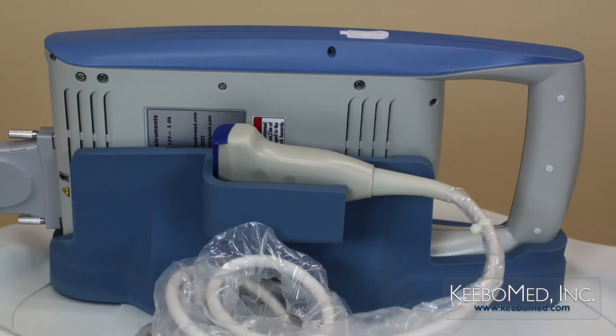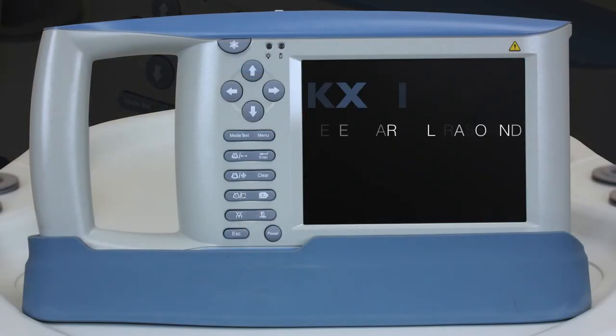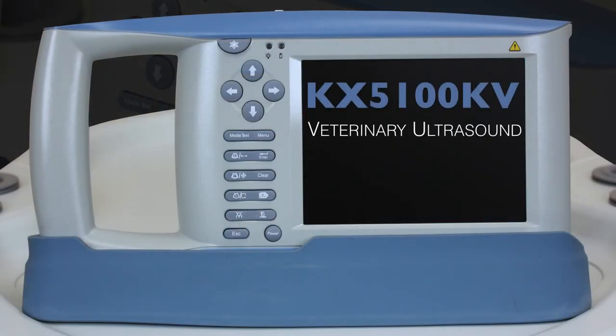For more information or to purchase the KX5100KV veterinary ultrasound, visit our website at kibomed.com. Thank you.